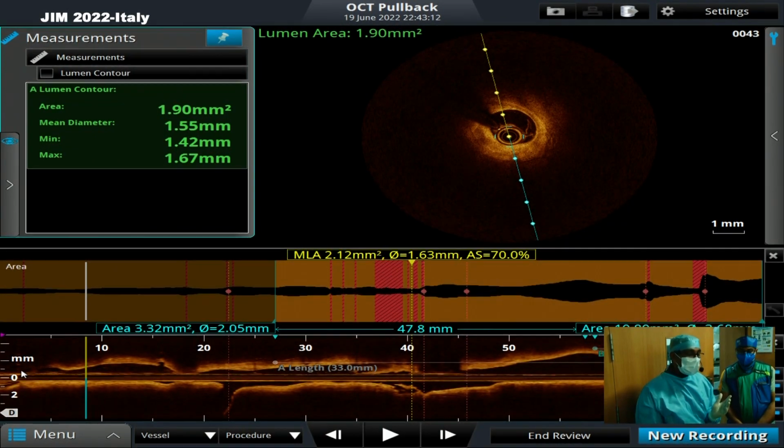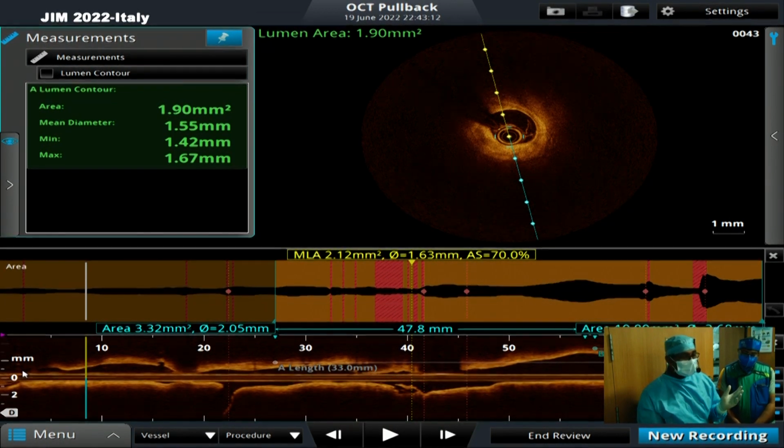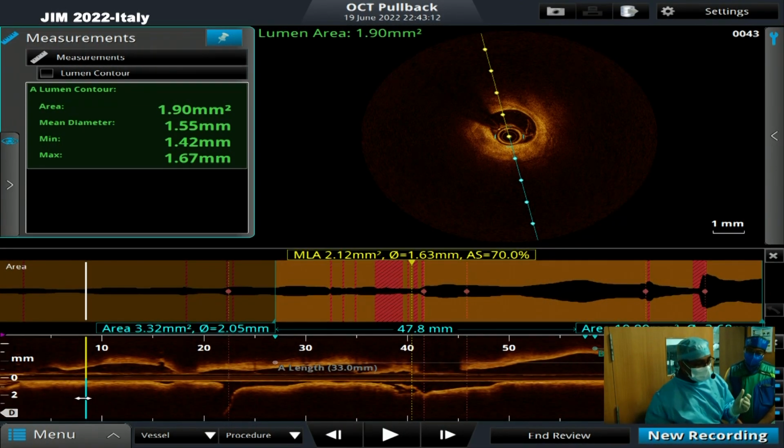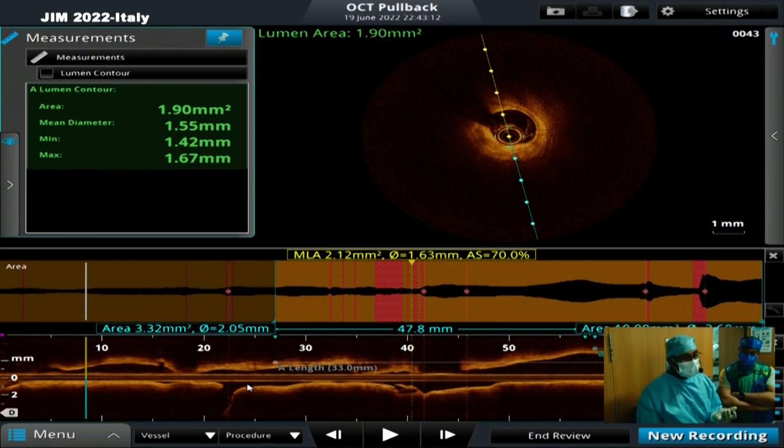Yeah. Based on the angio, the retrograde collaterals, we had a feeling that the distal LAD is significantly diseased. However, it was not critically diseased. If at all we had to stent that particular area, we'll have to put in long stents right from the left main into the most distal LAD. So we felt that this vessel should grow up once we open up the proximal portion. So based on the angiography, the retrograde collaterals, we felt that probably our stent should be parked proximal to the D2, this particular branch.